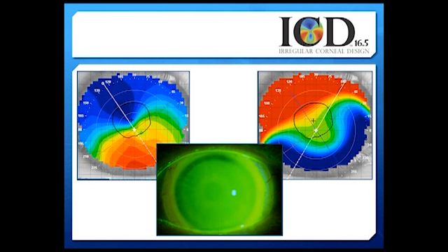Now, when you look at the corneal topography, the axial map in the upper left-hand side would indicate that the steepest point on the eye surface is this red. Is that the highest point? When we drop on the ICD lens, we see it vaulting through this zone. And in fact, the highest point on this cornea appears to be this arcuate area around here.